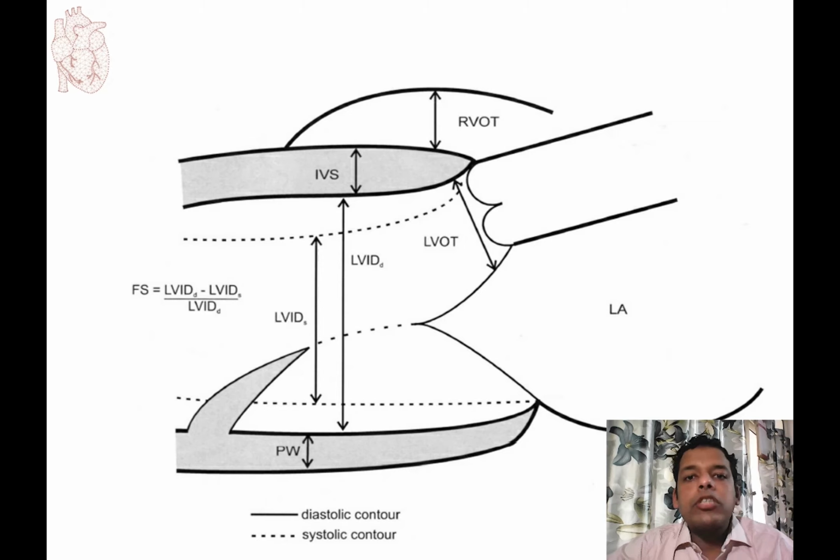Currently, the most common method for determining ventricular volumes is the Simpson rule, or the rule of discs. For our basic discussion today, however, we limit ourselves to the linear measurements only. We can discuss the details in another webinar, which would include measurements and calculations.